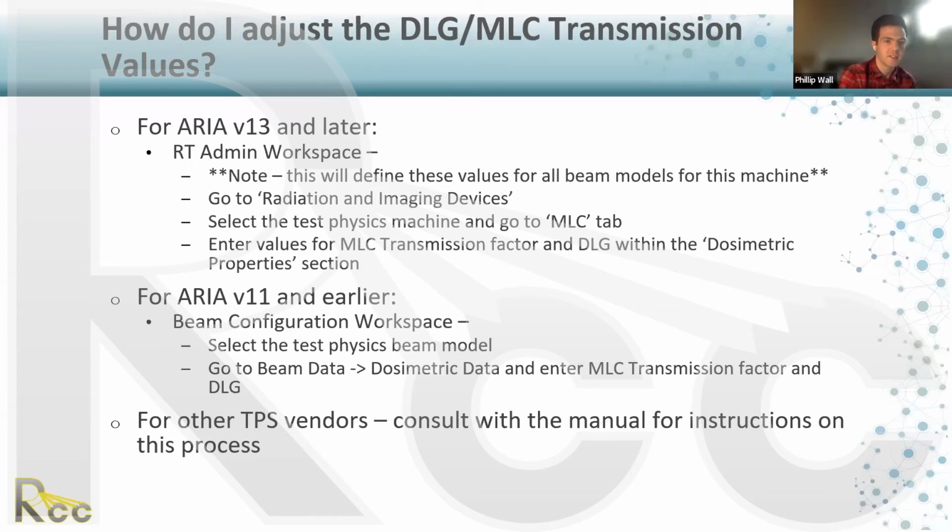Gotcha. So just to summarize, it's a real ubiquitous phenomenon that's called different things in different planning systems, but DLG is the most common, just because Varian is probably the most commonly used environment. So hopefully that clarifies that. Appreciate it. Thank you.